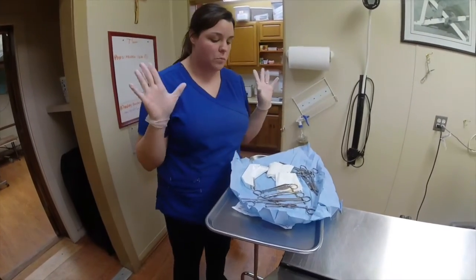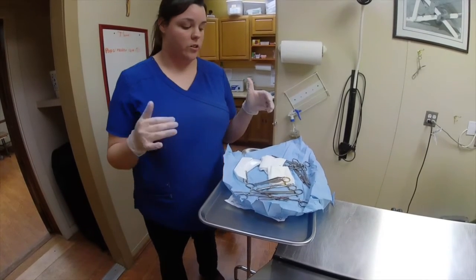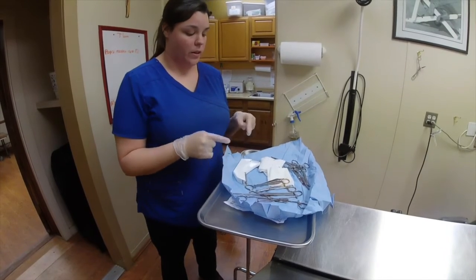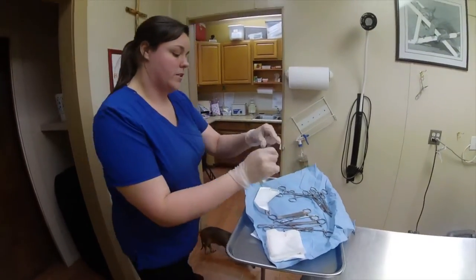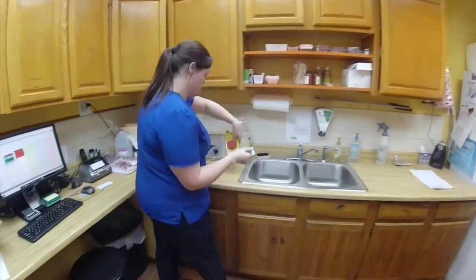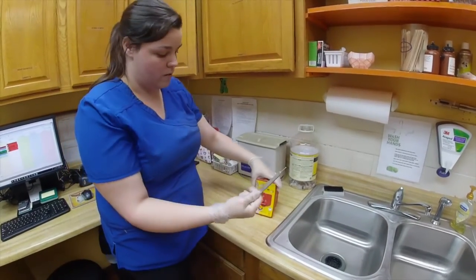Okay, this is how to properly dispose of a surgical pack once it's been used. You're going to make sure that all of your tools are still there. There should be 11 tools, a scalpel blade, suture material, stapler, and then our gauze. There's usually like 6 to 9 pieces in each. So first we're going to get rid of the scalpel blade. You insert it in here. You wait for the click, and then pull out, and that's how you dispose of that.